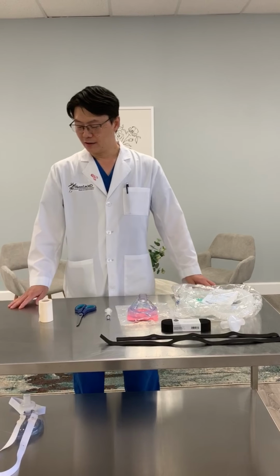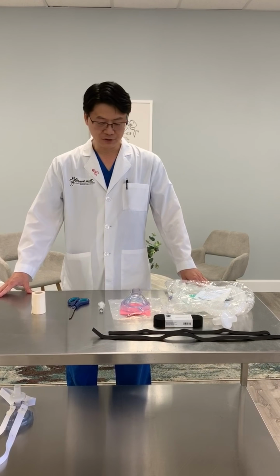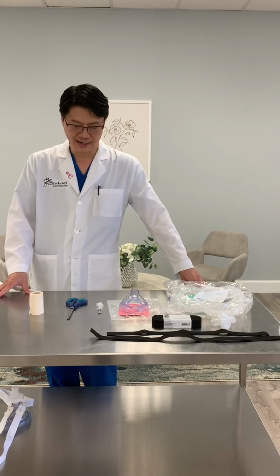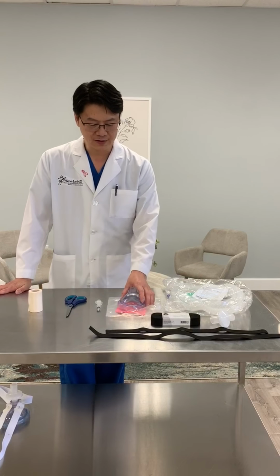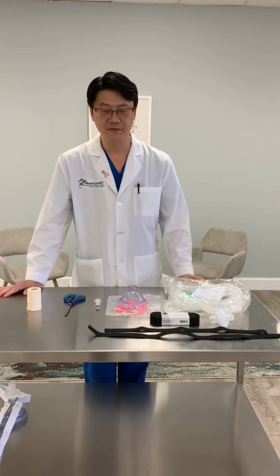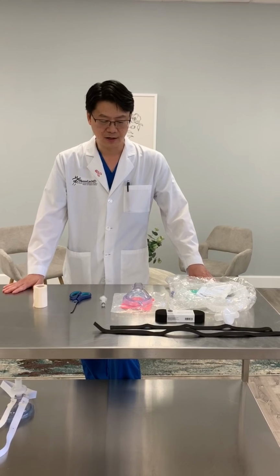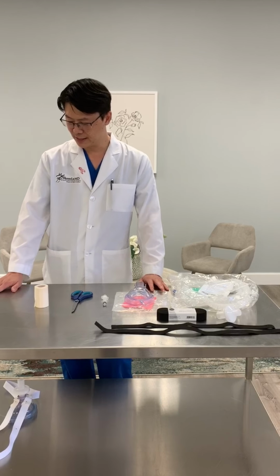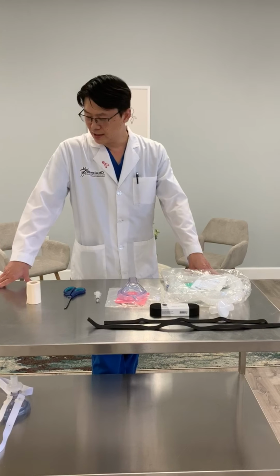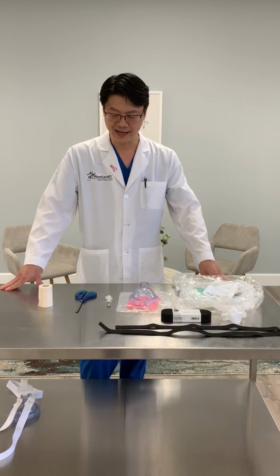We're going to show you our adaptation of the reusable elastomeric respirator for use during the COVID-19 viral pandemic N-95 shortage. Obviously, the disclaimer is that this is not FDA approved, but if you are short, this may be a good solution. So we will add the link for Dr. Brianna Slatnick's YouTube video. She's a resident from Boston Children's Hospital, so look for the link at the end.